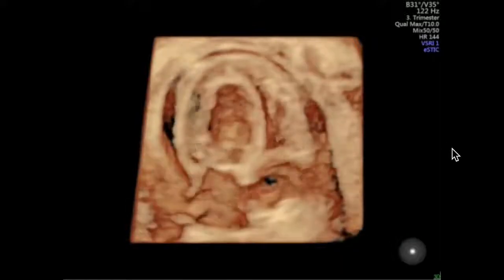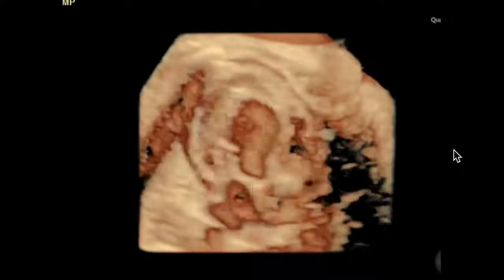Surface rendering, again, can be just surface rendering. So here we're looking at grayscale of a severe aortic stenosis with a kind of non-contractile EFE ventricle. And here's looking up into the LVOT where you're really not seeing any significant opening of the aortic valve.